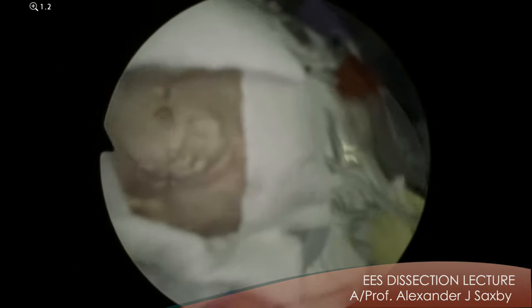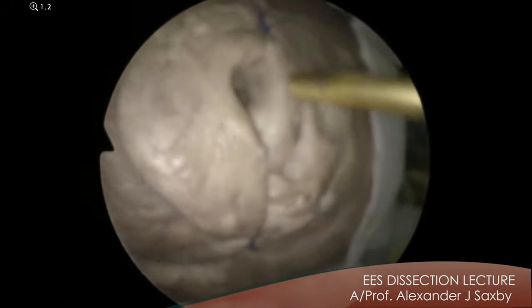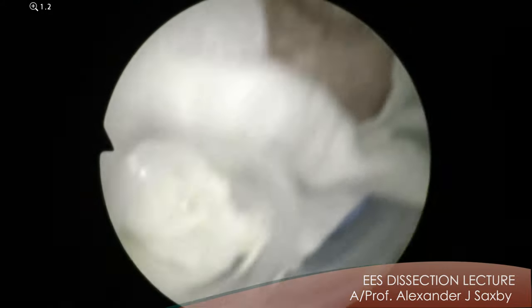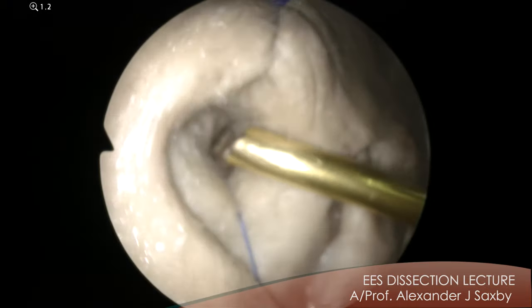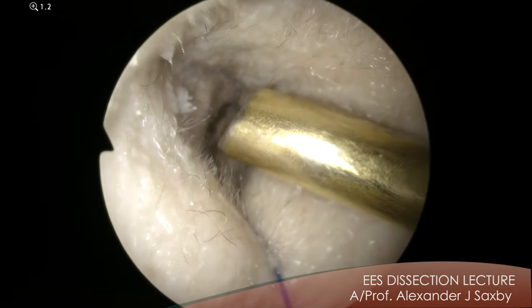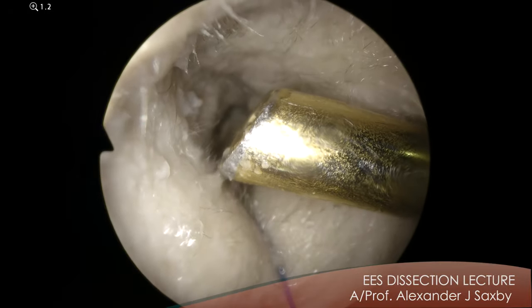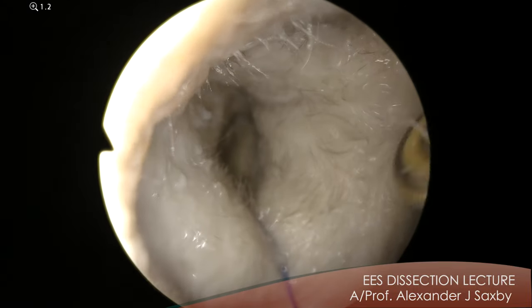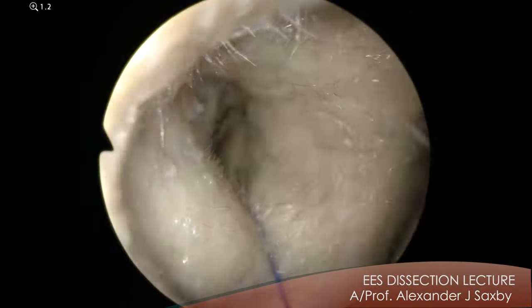So when you place your scope into the ear, if you put your scope straight into the hole, more often than not, you'll hit a hair on your way in, and then you're blinded. So it's much better, if you see the gold area on this tip, to place that on the side wall first. Place that on the side wall so that the tip of the endoscope, which is the optic part, is in the midair. And then go into the canal. If you just try and go in straight off, you'll hit something. So get stability on the side and then go in. It can be very quick — you won't even notice you're doing it when you've done 100 cases, but at first, just put the scope on the side and then go in. That way you won't hit the hairs.